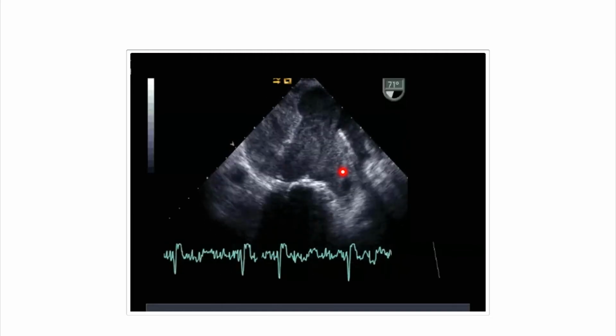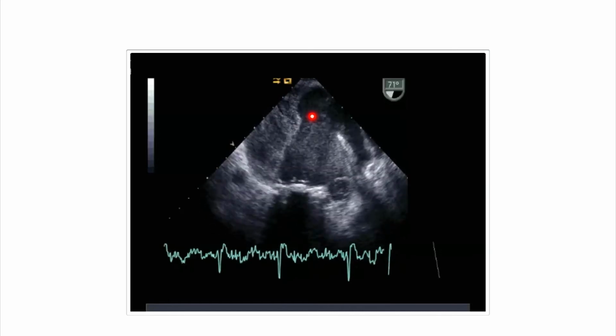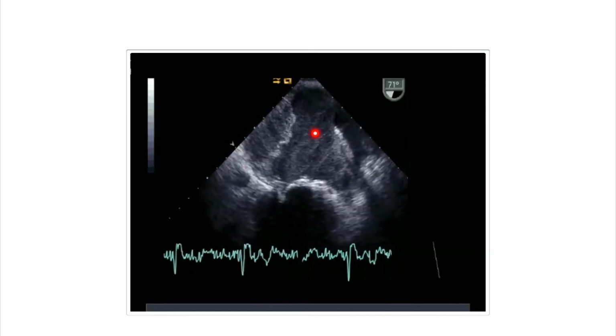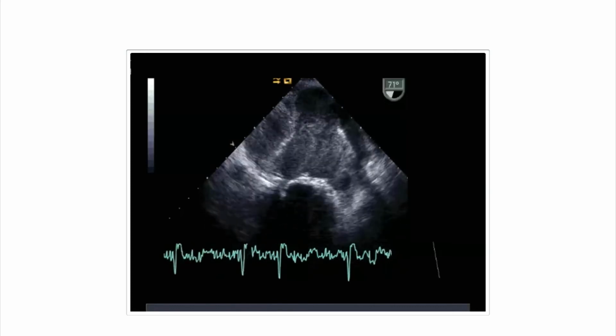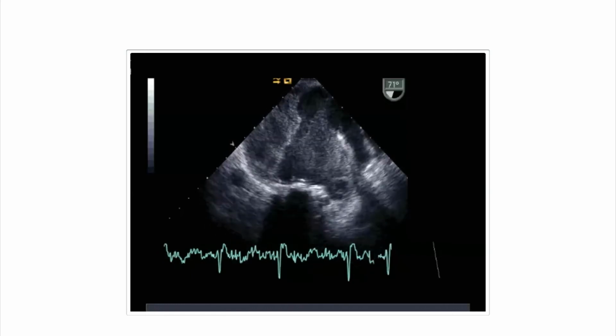This is the left atrial appendage, and there's probably even some clotting here. On top, we see that there is spontaneous contrast. This patient also had a mitral valve bioprosthesis in place, and all this together with poor left ventricular function increased the risk of thrombus formation.